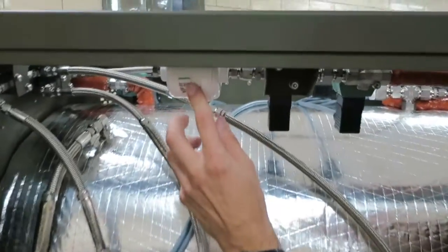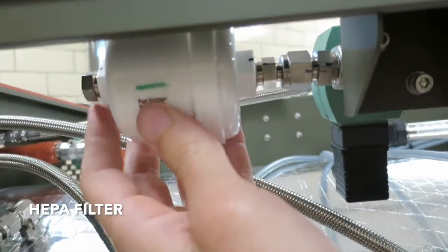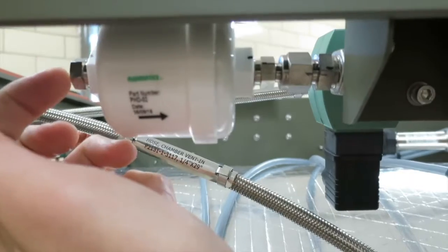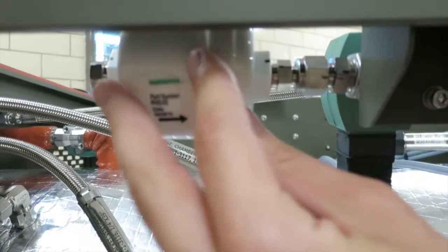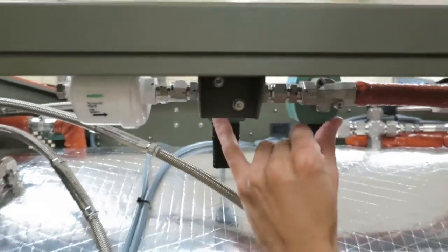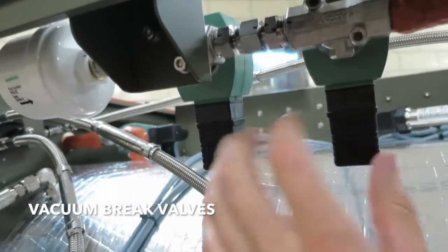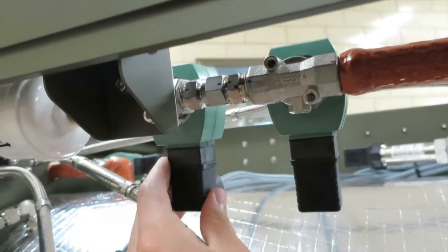Right here we have the HEPA filter. Whenever there's a vacuum on the chamber and you want to open the chamber door, you can't allow dirty air to go over the instruments. So air is drawn through the HEPA filter, cleaned so all the dirty stuff is removed, to break the vacuum on the chamber so you can open the door. These two valves are what open when you need to do that. Whenever you press vent on the PLC, these two valves are activated. Again, they're the same solenoid valves as the vacuum valve.